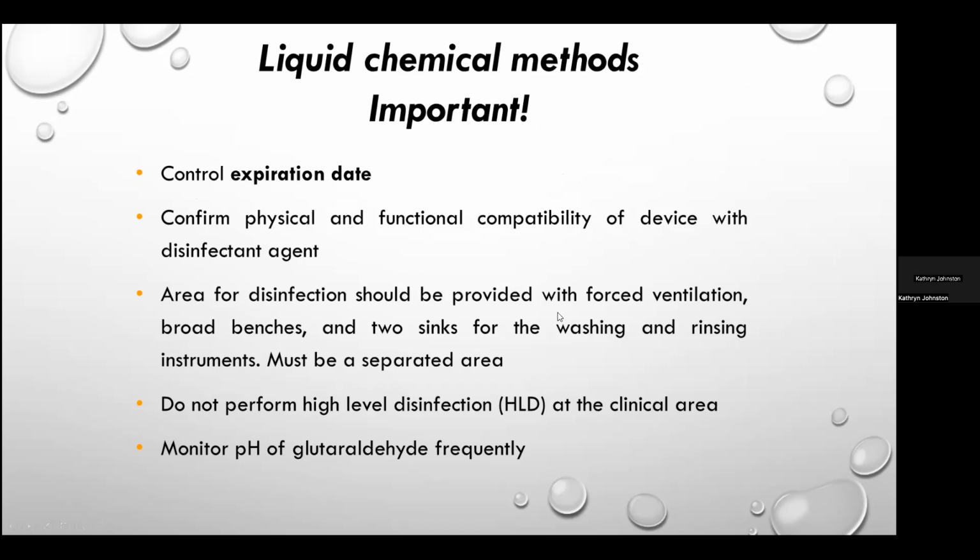One key critical point is that you have proper forced ventilation wherever you're doing this disinfection, because some of these agents can be toxic, and you can have reactions to them. You don't use the same sink for washing and rinsing instruments. They have to be separate. And you don't want to perform high-level disinfection in the actual work area. It should be in a separate area.